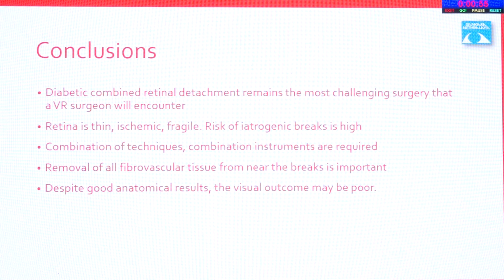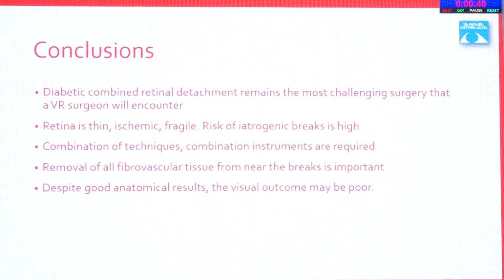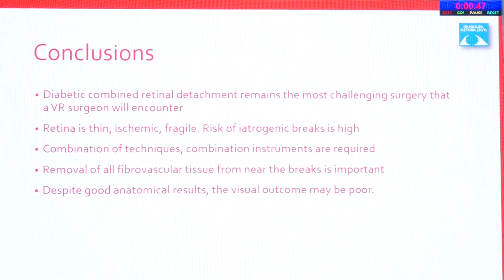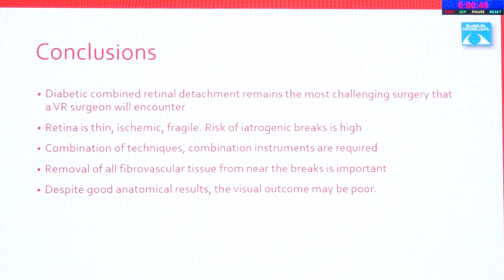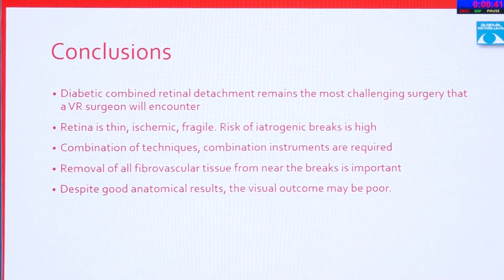Combination of techniques and combination of instruments, such as multifunction instruments, also can be used. Removal of the fibrovascular tissue from near the breaks is very important. And despite good anatomical results, sometimes the visual outcomes are quite poor. So you need to counsel the patient accordingly.